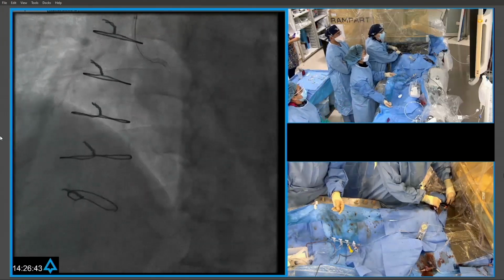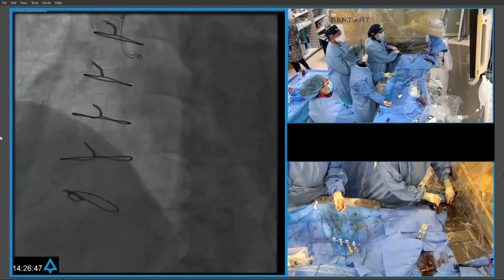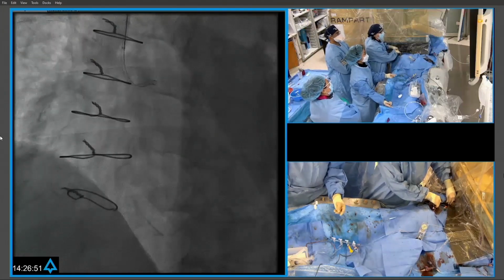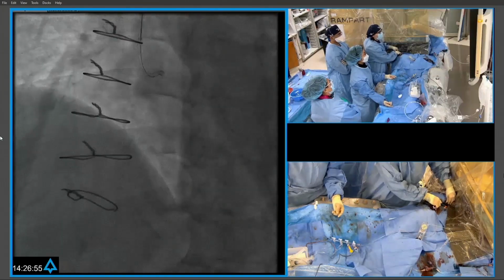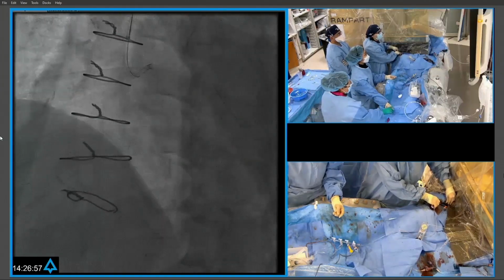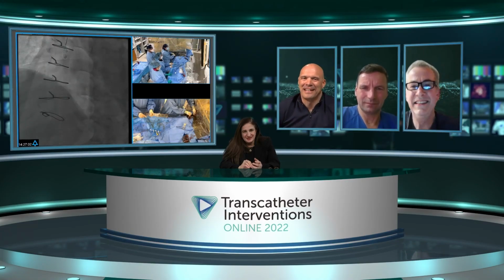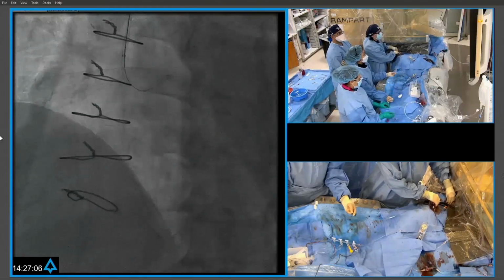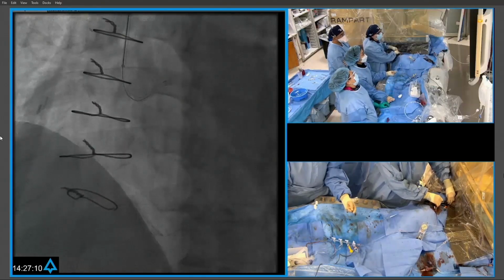Just the fact that you have better angios. So you'll see I got over enthusiastic there with a microcatheter. So I've sprung everything out, so we'll need to set up again, but we'll hopefully do that quite quickly. So it's always good to see that people are human. Good to see that it's not only me that does that. Oh, no, and also every single time one of the panel said that this will be straightforward, easy antegrade, I was biting my tongue.